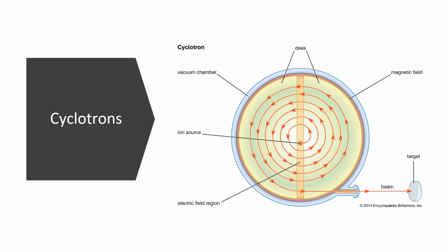foil paper, and it will hold the electrons back and only allow the proton beam to come through. We call it a beam because it's essentially a stream of protons, and they will bombard that target. The target nucleus will take on those protons and become proton rich, which forces them to become unstable and then decay by positron. A lot of times there's something very simple used in the target, like stable water. And so as it bombards that with protons, then it becomes proton rich.